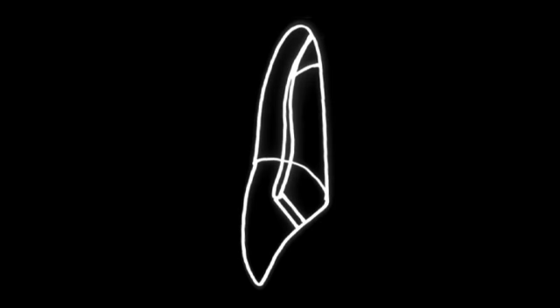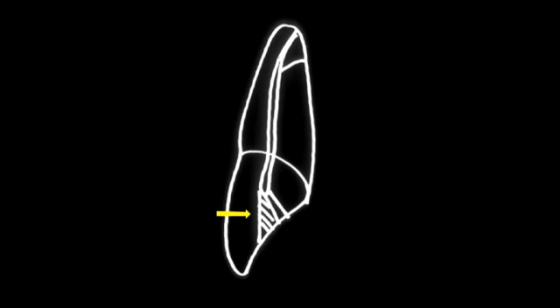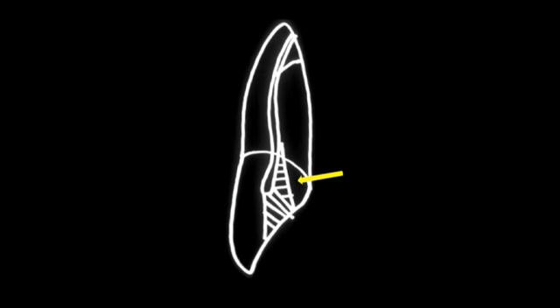easily measured. First, triangle 1, which is essentially in enamel, can be removed by penetrating and flaring with your original number 2 round bur, for example, in an anterior tooth. And then there's triangle 2 that is essentially dentin, which can be removed with a Gates Glidden, X Gates, SX in the ProTaper series, ProTaper Next series. There's a multitude of instruments that can remove triangle 2. The key is to remove them.